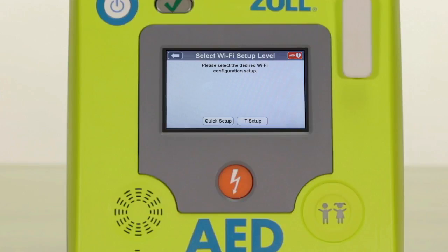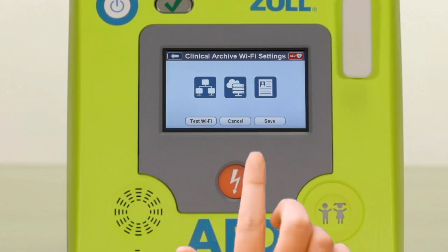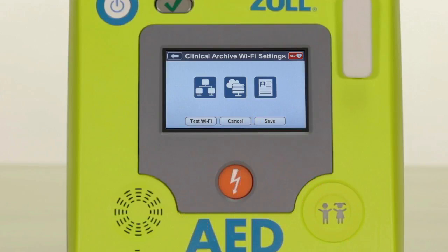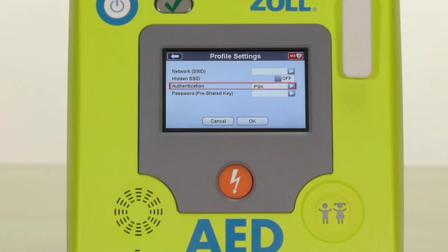At the bottom left of the screen, in both the report Wi-Fi setup and program management Wi-Fi setup screens, there is an option for IT setup. It is recommended that you involve your network administrator if you wish to make any configuration changes in this screen. The ZOL AED3 supports both WPA2-PSK, which uses a pre-shared key, and for more secure networks, WPA2-802.1X, which requires a certificate. Your network administrator will know which method is preferred.